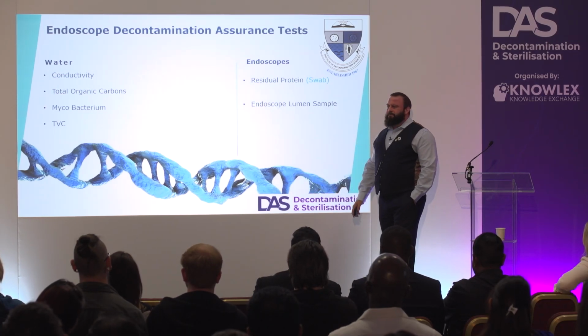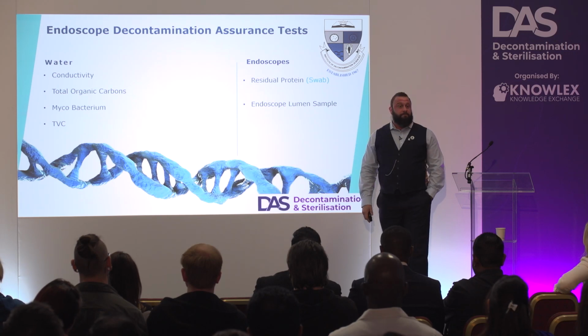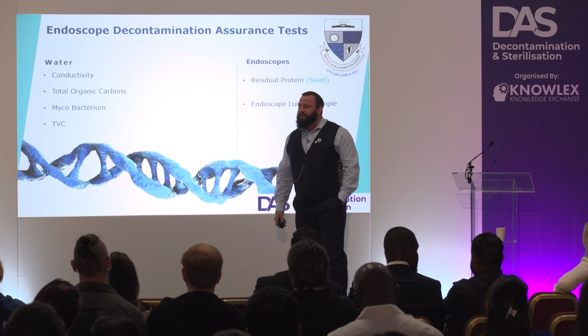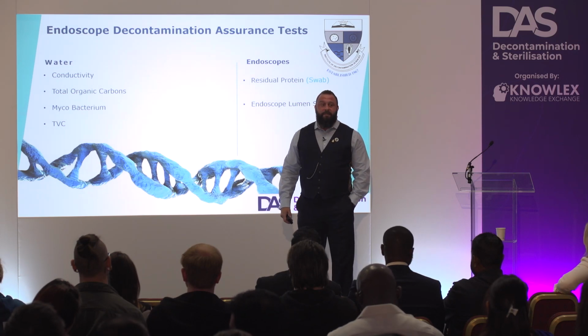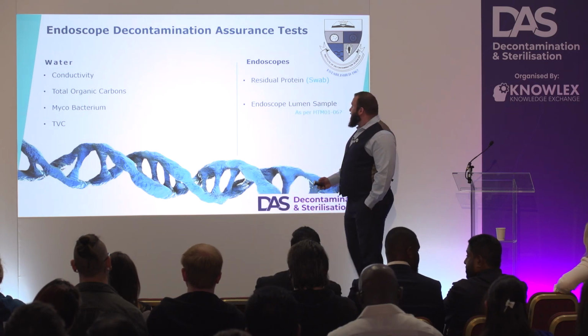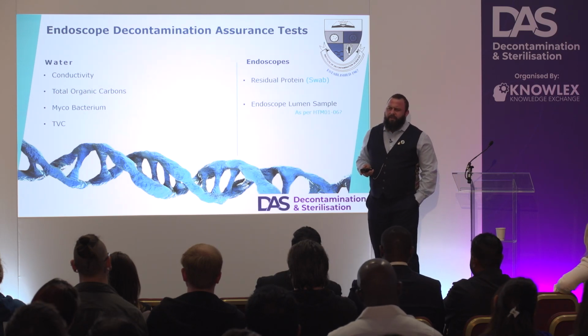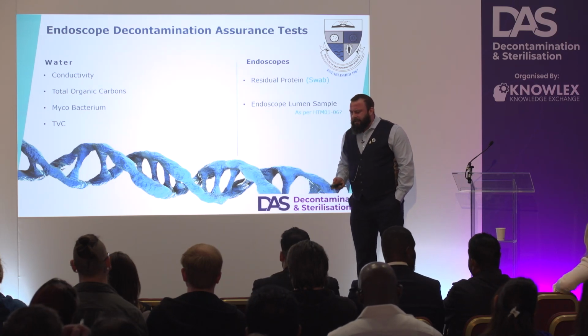Endoscope lumen sample. How many people are doing that test? You're sampling the actual scope's lumens, what's inside. No hands? It is actually mentioned in the HTM to do it, but there's a bit of a get out with the HTM, which is a bit of an odd one, saying you don't have to do it.